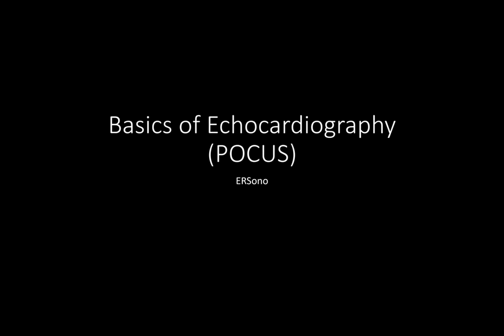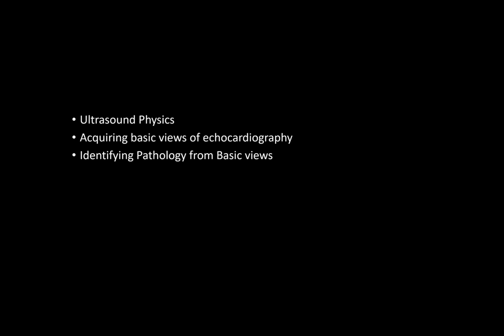Today we'll discuss and learn together about basics of echocardiography. We will take you through ultrasound physics, acquiring basic views of echocardiography, identifying pathology from basic views, and a simulated time at the end.